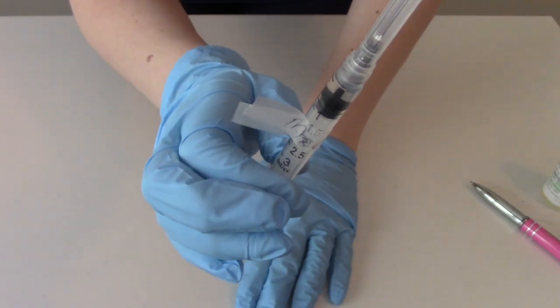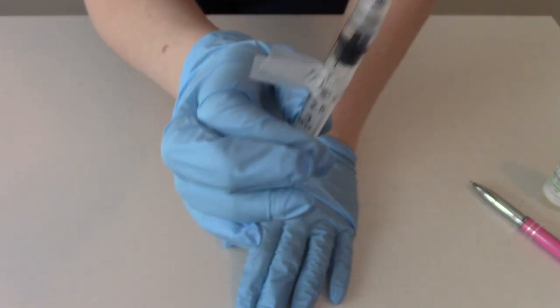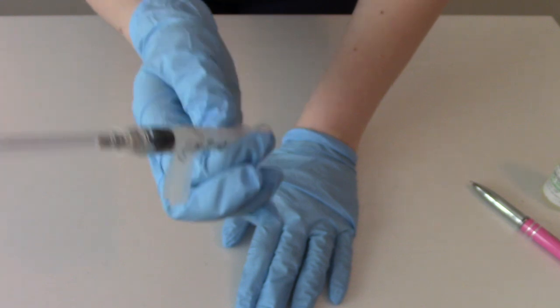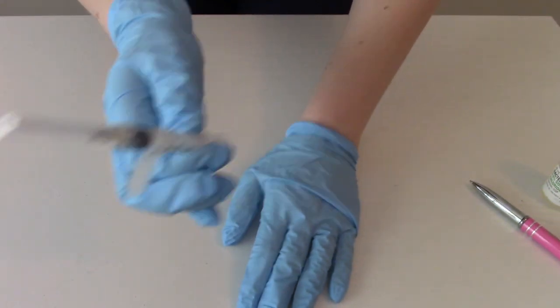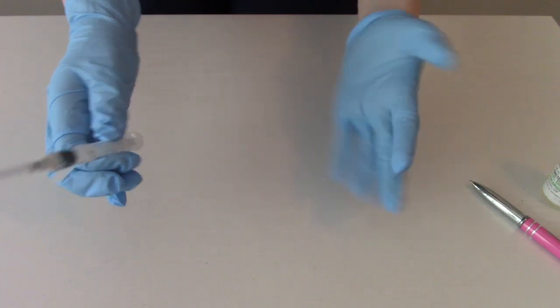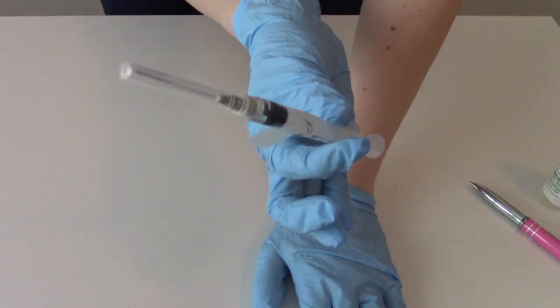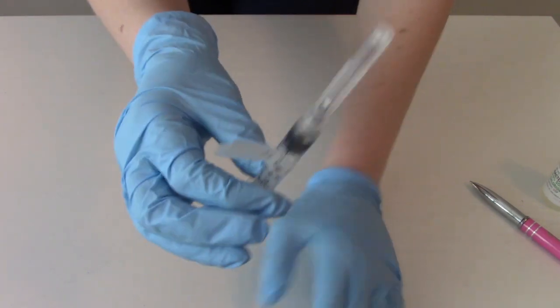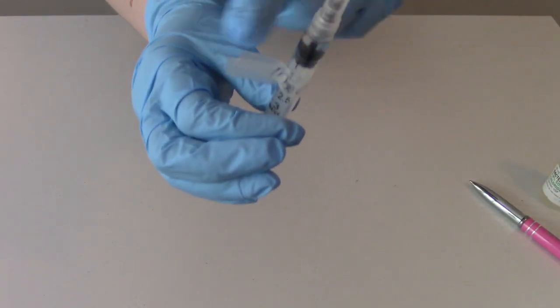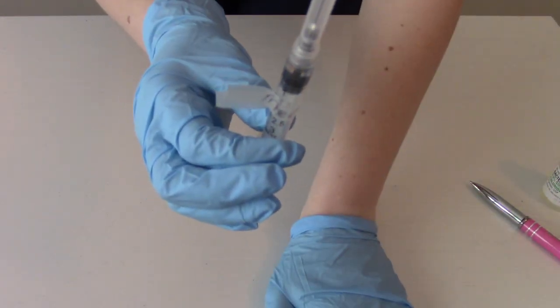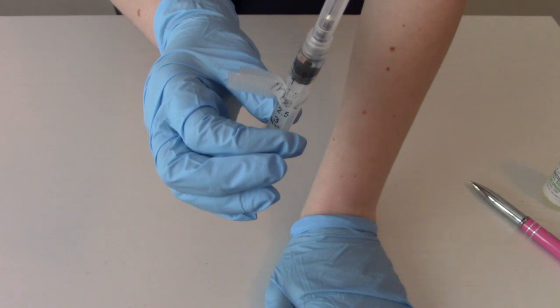One other thing I wanted to mention is we should always label our injections. Because if this was to fall on the floor or you saw it on somebody's computer on wheels and you weren't inside the room and it's just some random unknown clear liquid, we don't know what it is. So either take a piece of tape and write the name of the medication on it, or there's actual little stickers that are medication labels you can put on the syringe. That's just a safety thing you should always think of.